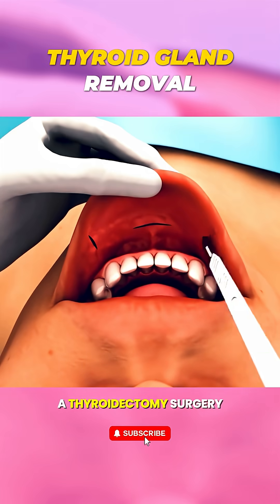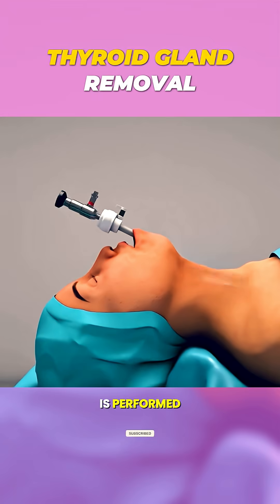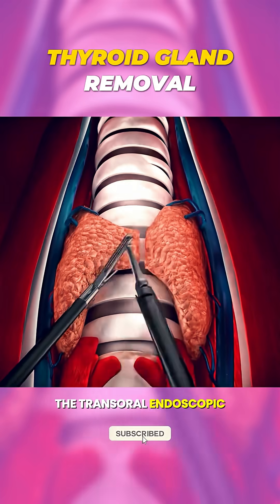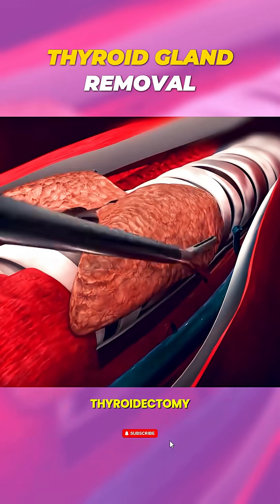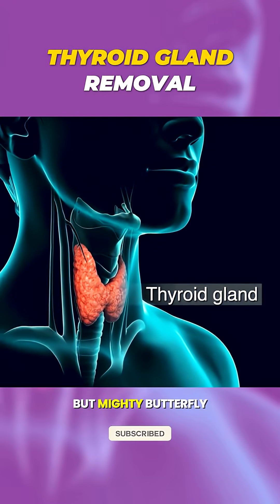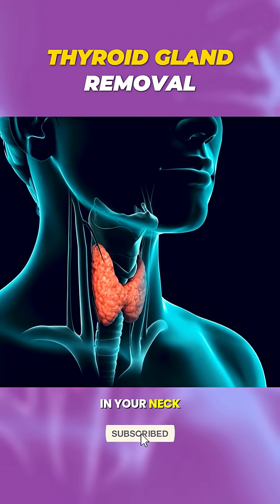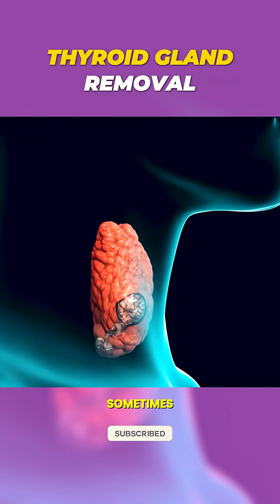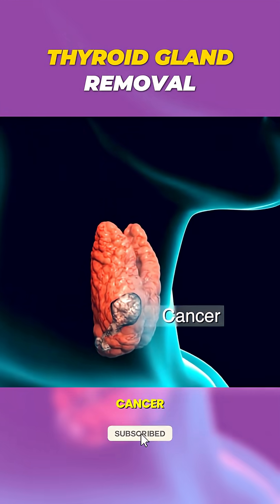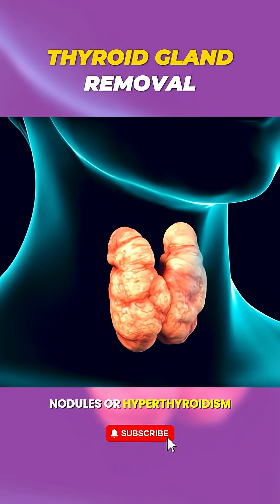Ever wondered how a thyroidectomy surgery is performed? Let's talk about the transoral endoscopic thyroidectomy. The thyroid gland is a small but mighty butterfly-shaped gland located in your neck. Sometimes it needs to be removed due to conditions like cancer, nodules, or hyperthyroidism.